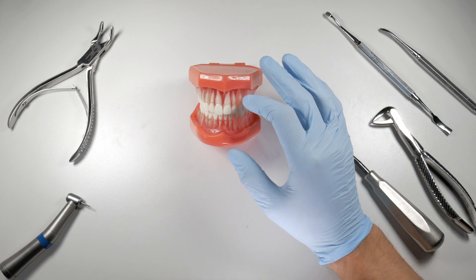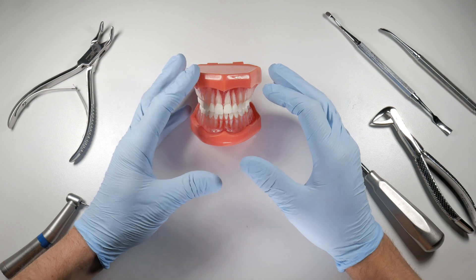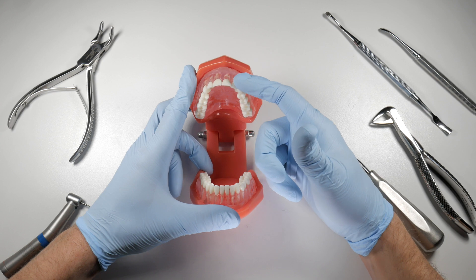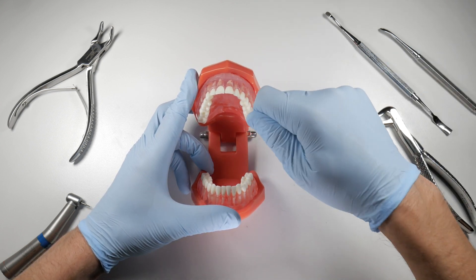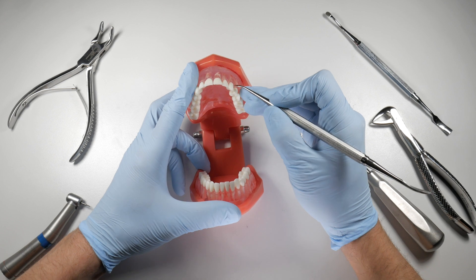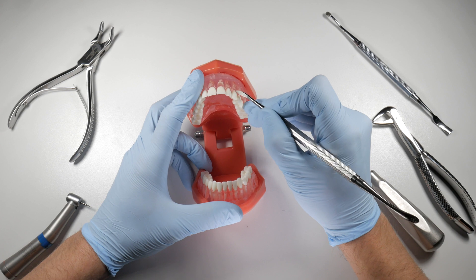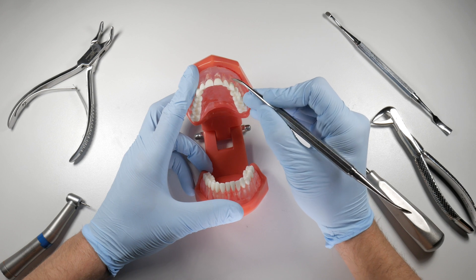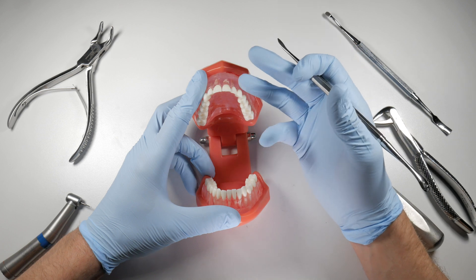If you can't separate the bone from the tooth, you'll have to accept that the bone is coming out with it. You may need to lift a flap a little bit, because if it's a decent section of bone and you just pull, you'll tear the flap. Using your periosteal elevator — say you're working on the upper canine — release the papilla and undermine a small flap without formal incisions. You want to undermine enough of the flap that you can bring that bone through without applying tension or tearing.